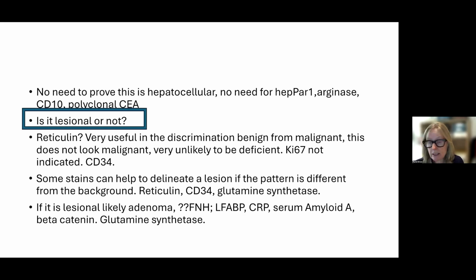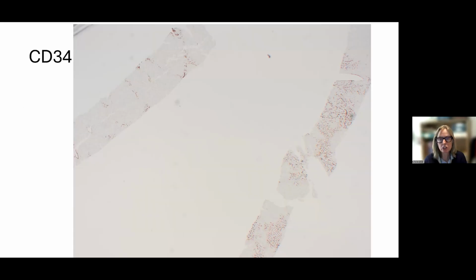It had already had some staining at the external institution, and a CD34 had been done. And I think this shows you, in this core, we're looking at background liver here. So the CD34 stains endothelium in periportal regions in the normal liver, but not beyond that. So rather unusually, really, because of the specialized nature of hepatic endothelium, it doesn't stain with CD34 beyond this periportal region.